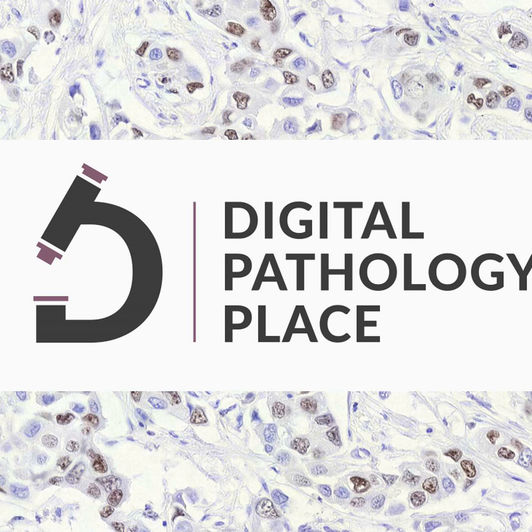If you don't have digital slides, then you will be limited in your ability to evaluate Immunoscore, and there are limitations with traditional tumor infiltrating lymphocyte assessments. You have the traditional one where you can stain them with IHC, but also often without even staining. This one is specifically stained for CD3 and CD8, and then you calculate the ratios of these to each other and in specific places in the invasive margin, similar to what we said with the esophageal cancer.